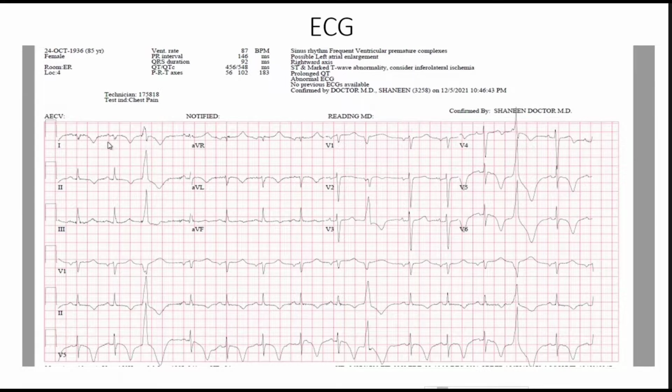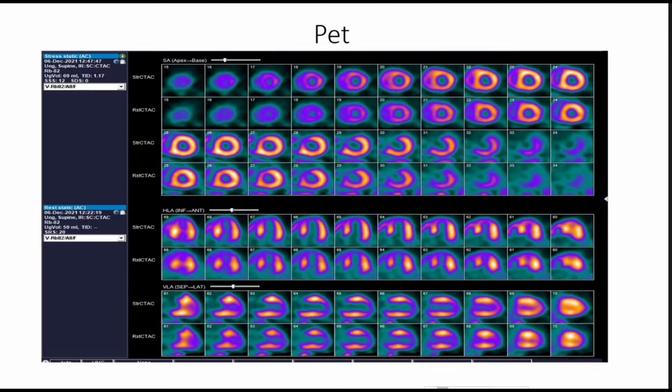She's in sinus rhythm, and she also has some nonspecific changes, more isolated to just 5 and 6 that you're seeing with some over in lead 2. So really a non-diagnostic EKG for answering any of the questions that was going on.